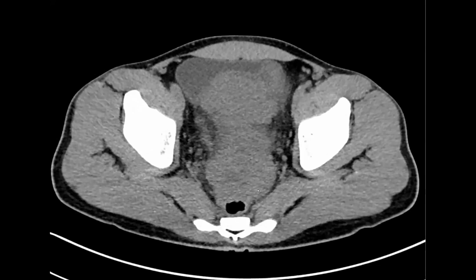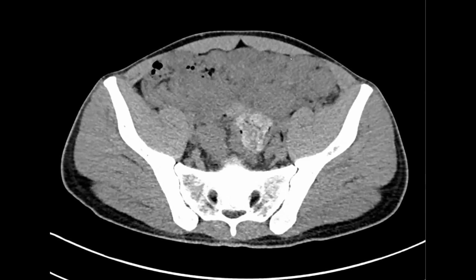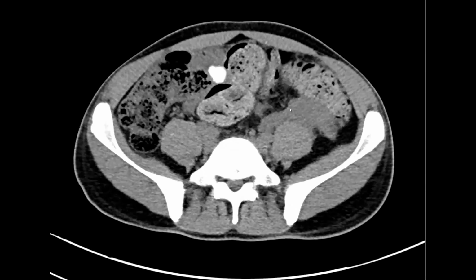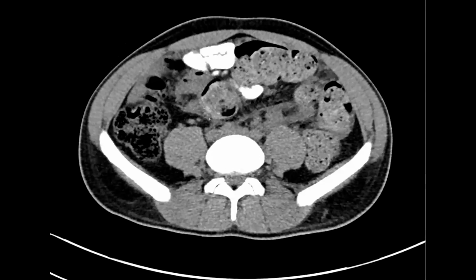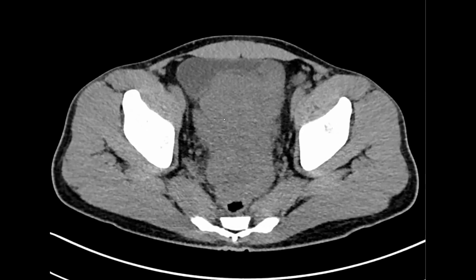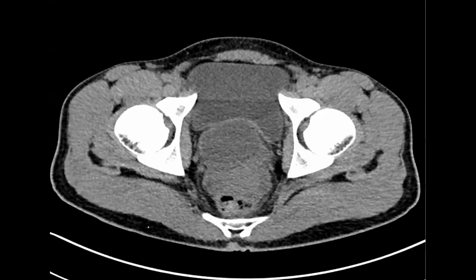What's a little bit harder to see initially is that all of this is also mass. There's all this mass here. It's a non-contrast exam, so it's a little hard to see. But the bowel is up here, nicely opacified with contrast. And all of this is basically extensive peritoneal disease. And then there's this big mass here as well, and then this cystic component here.